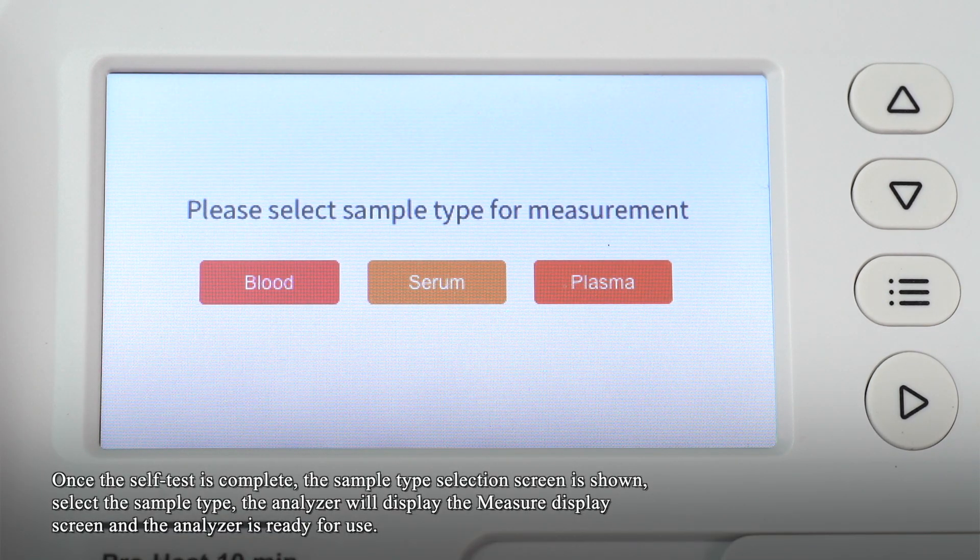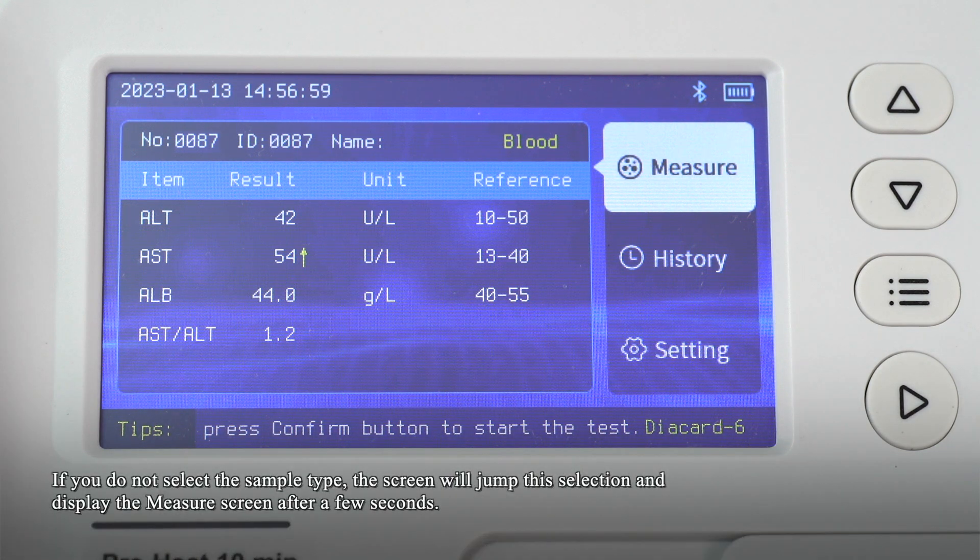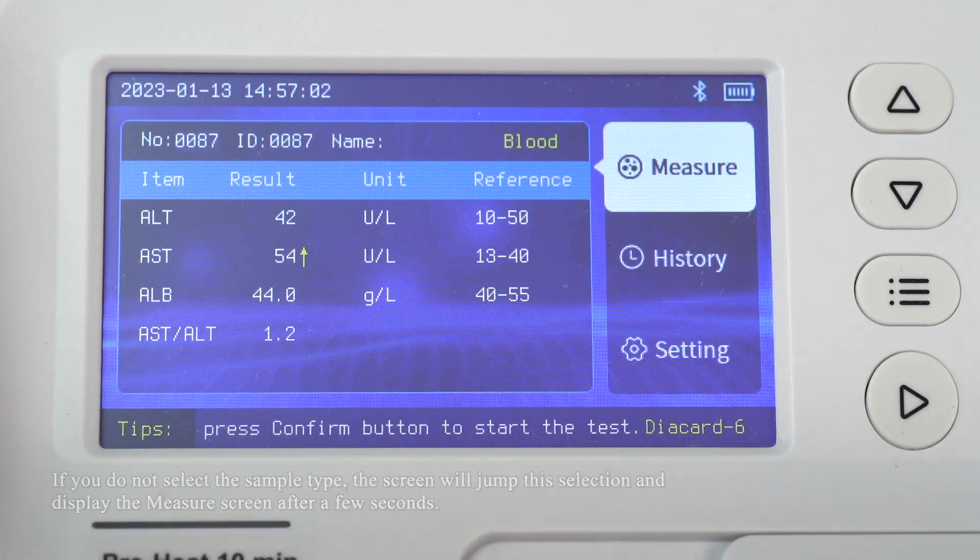Once the self-test is complete, the sample type selection screen is shown. Select the sample type. The analyzer will display the measure screen and will be ready for use. If you do not select the sample type, the screen will skip this selection and display the measure screen after a few seconds.